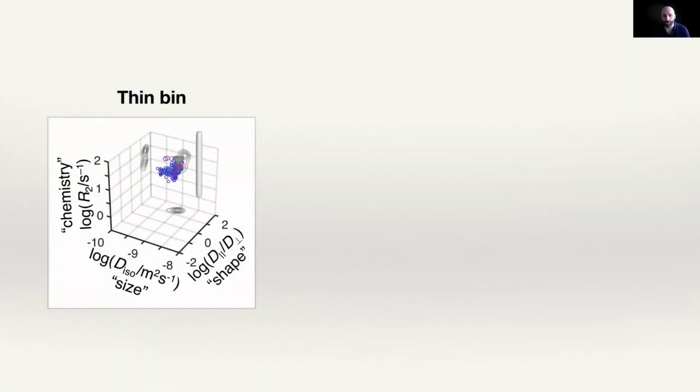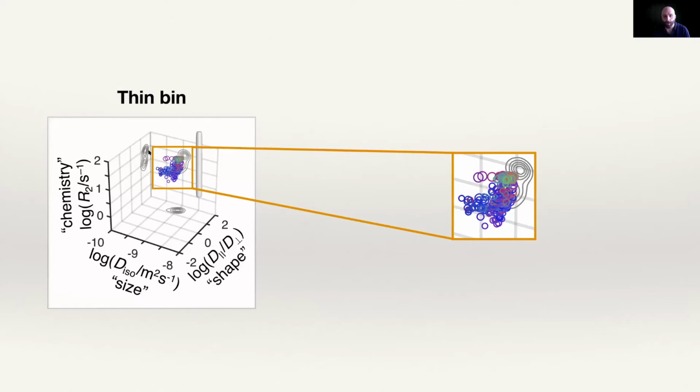So what I've been doing recently is using this thin bin, zooming on this and seeing all this wealth of colors and being like, let's try to take this bin, just fiber stuff, and then let's try to isolate agglomerates in the orientation space, or clusters in the orientation space. And if you have a lot of solutions that happen to end up in the same orientational region, they are probably associated to an actual fiber in that voxel.